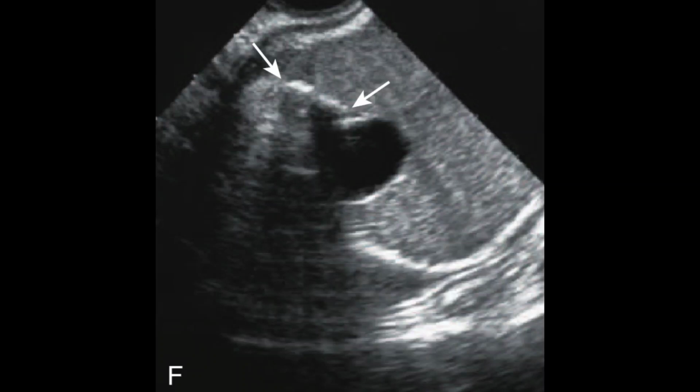Multiple tiny calcifications can also be seen there. You can call it calcific foci, and beside that there is a cystic area. So cystic areas, a homogeneous echogenic pattern with calcific foci. This is another pattern of the dermoid lesion or cystic teratoma. So cystic teratoma may appear in this fashion.